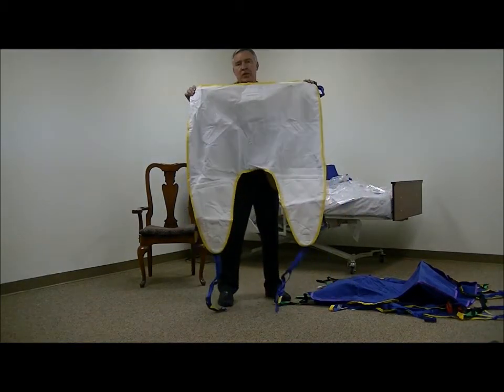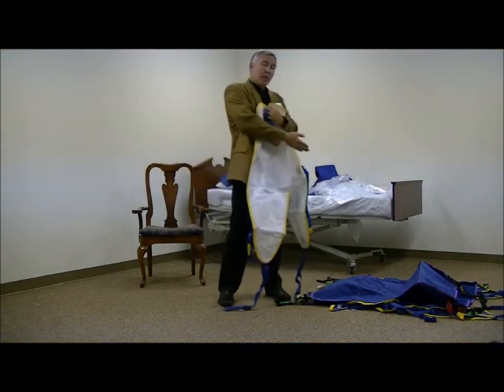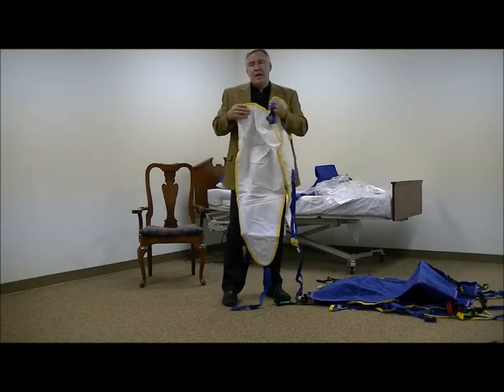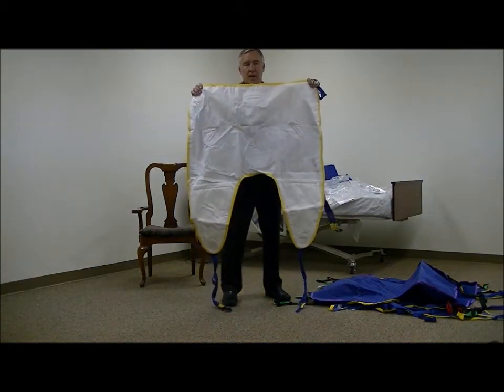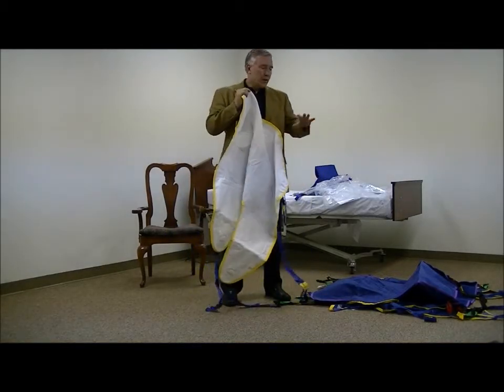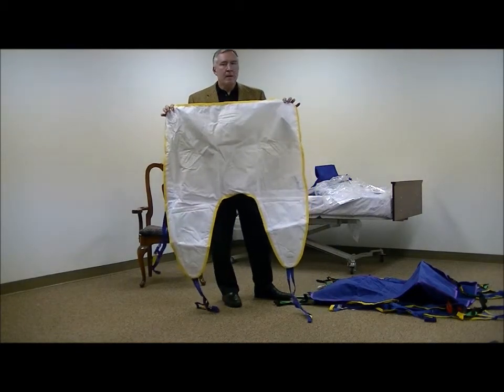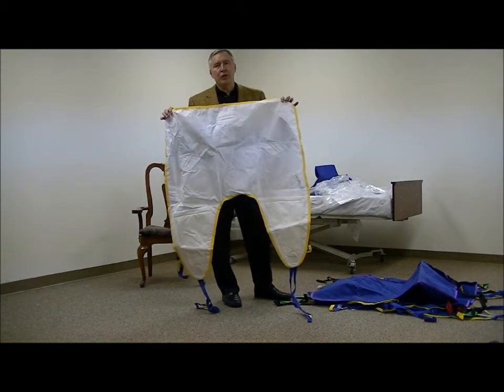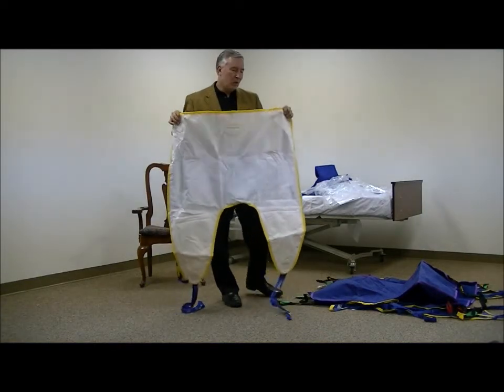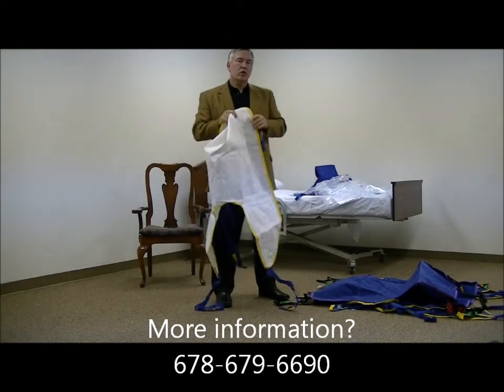It's also important to understand that these slings, if they're used on one patient, in some cases they can be removed, and some people actually use them from patient to patient. And that is a difficult judgment call to make because infection control is such a serious issue. If something was to happen and there were to be a cross-contamination from patient to patient, that could be a significant liability for a facility, needless to say, affecting the quality of life of the person that the sling is being used on. So this method eliminates both of those concerns.